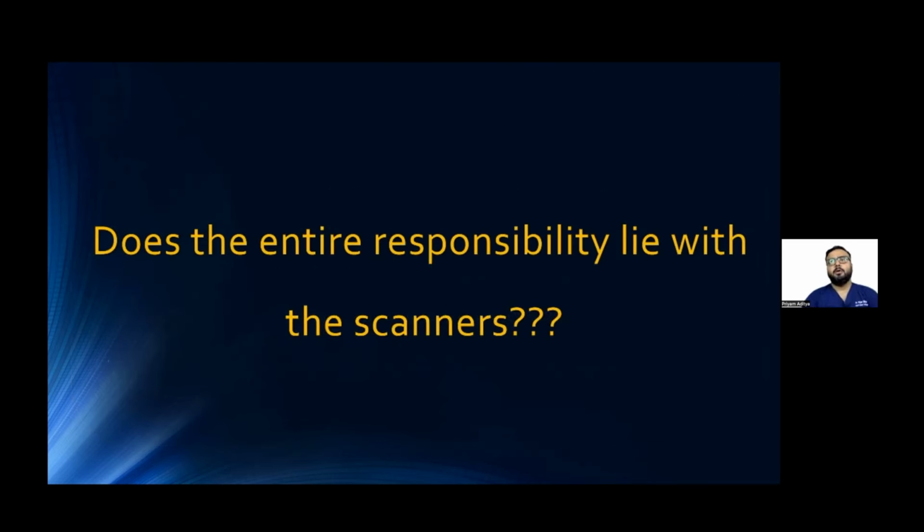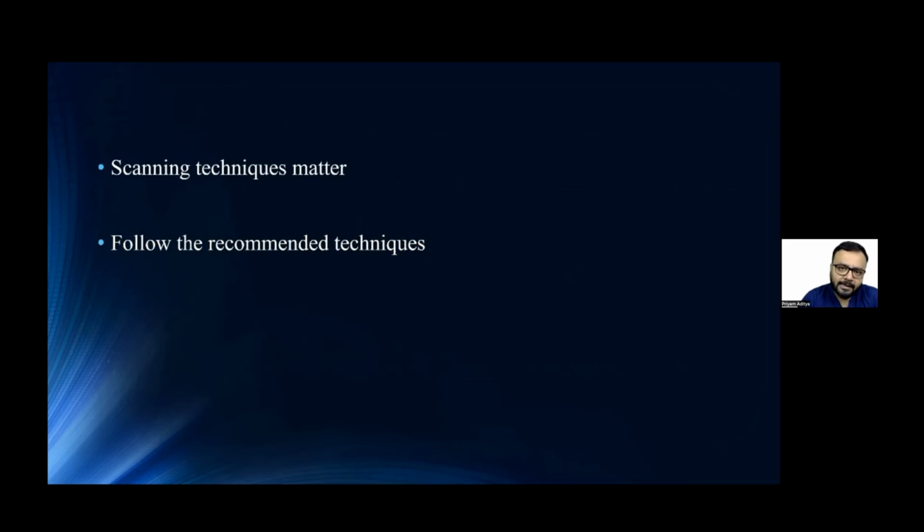But having said these points, and I'm somehow boasting only about scanners, does the entire responsibility lie with the scanners only? Does it mean that if I give a very, very good scanner to a beginner, he or she will get me a fabulous scan? Not true. You need to perfect your scanning techniques.